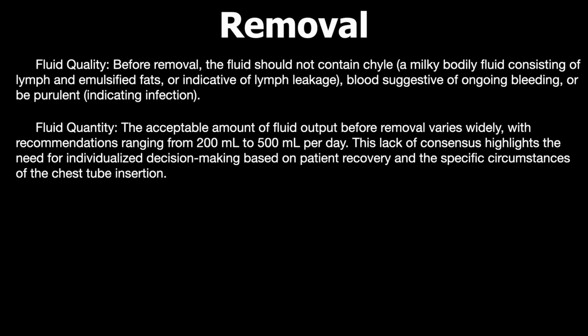The acceptable amount of fluid output for removal varies widely, with recommendations ranging from 200 to 500 ml per day. This lack of consensus highlights the need for individualized decision making based on the patient's recovery and the specific circumstances in which you have inserted those chest tubes.